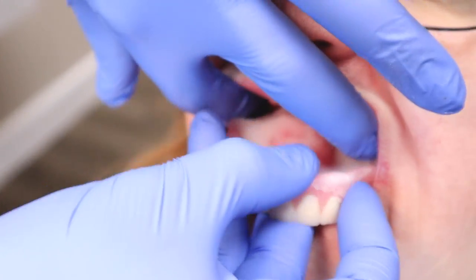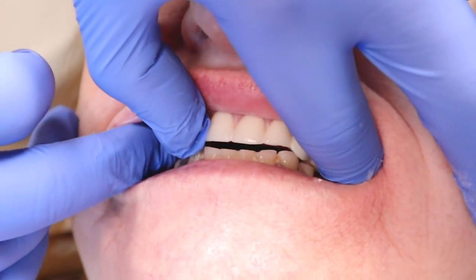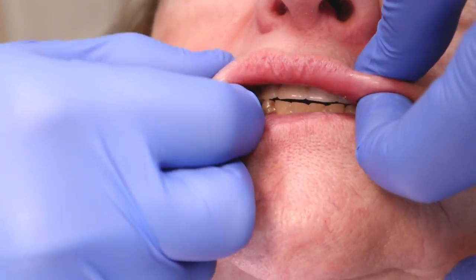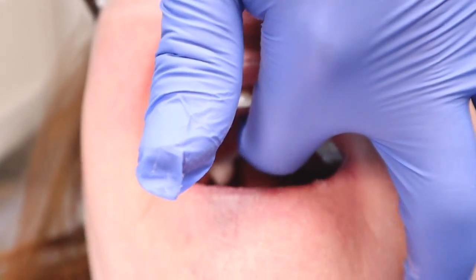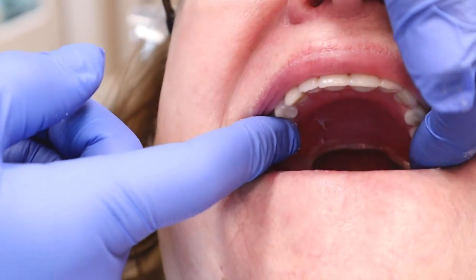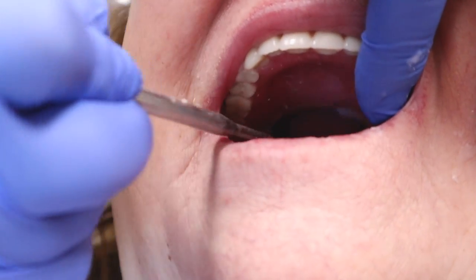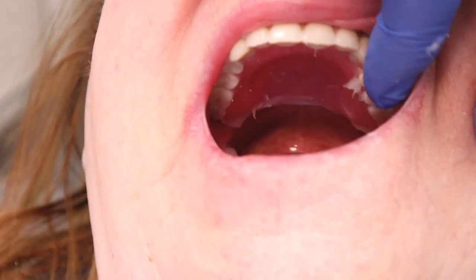As I put it into the patient's mouth, I seat the posterior part first and then the anterior part so the material flows forward instead of back. I also take the patient's lips and do border movements, because that helps emphasize all those movements and prevents overextension of the denture. Even though I try to put minimal material, there's still some overflow toward the back, so I use the mirror to scoop it out and keep scooping to make sure the patient doesn't gag.